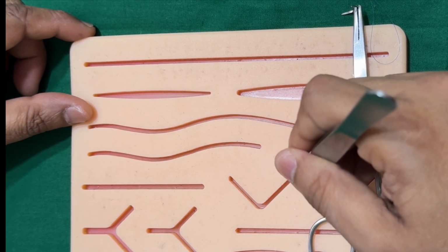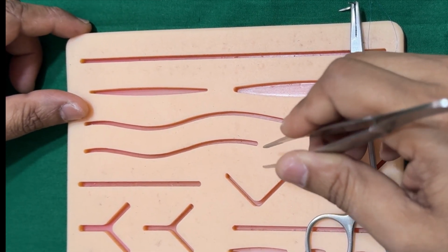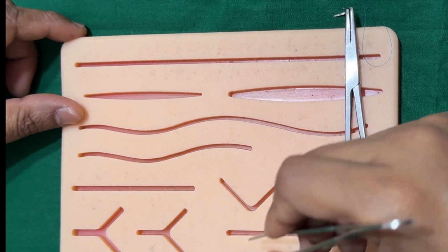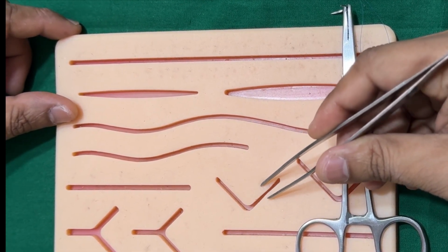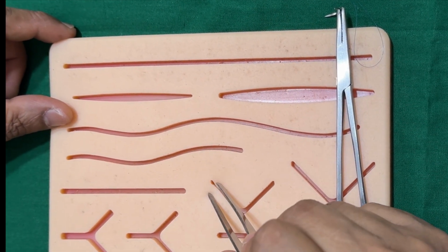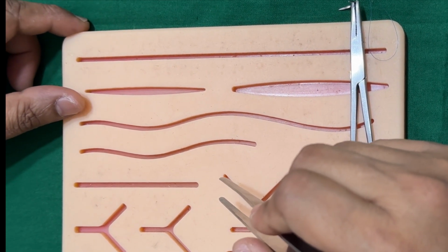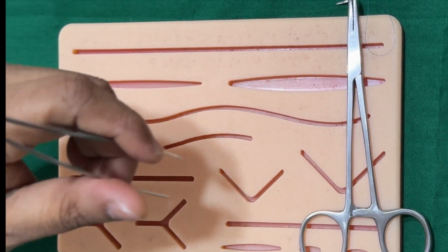Now here you have the angles, so there are certain things which should be considered. If we consider that, we will easily and perfectly approximate the wound edges all around, even in the angles, understood? But if we don't consider it properly, the wound edges will be approximated to each other, but the exact angle or corner will not be approximated, leading to chances for infection as well as scar. So let me explain here.